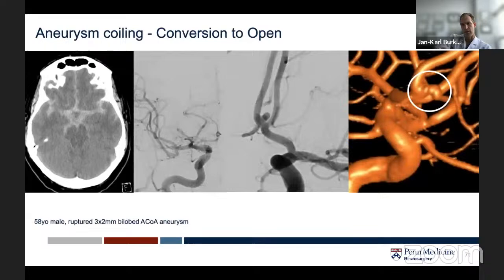the treatment options. So here, that's a case with a ruptured aneurysm that looks like a favorable case for coiling actually. But if you look more at the 3D, you can see there is an additional wide neck portion with an additional bleb, so it makes it really, really wide neck. So it's challenging for just intrasaccular treatment if you don't want to add a stent. I gave it a shot anyway.